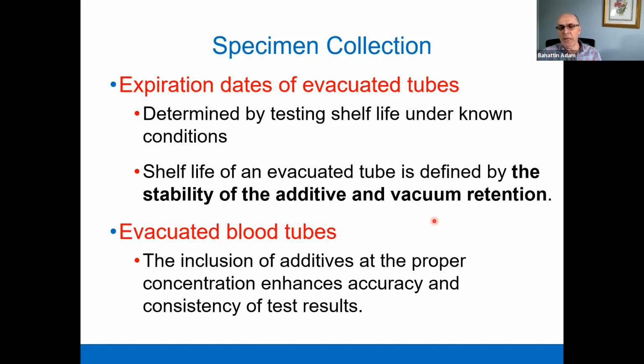Okay, you need to check the expiration date of test tubes before you use them. If they expired, they may have lost their vacuum, or the additive may be spoiled, and therefore you should discard such test tubes.